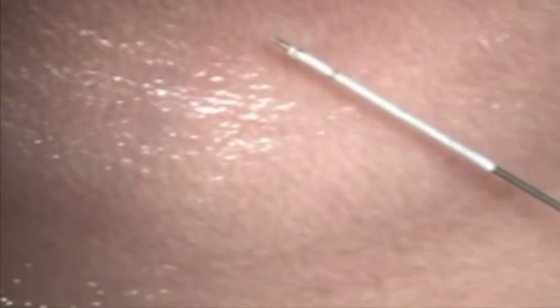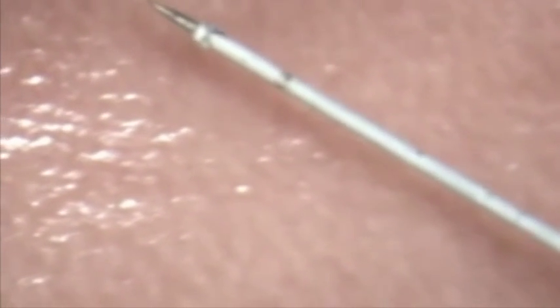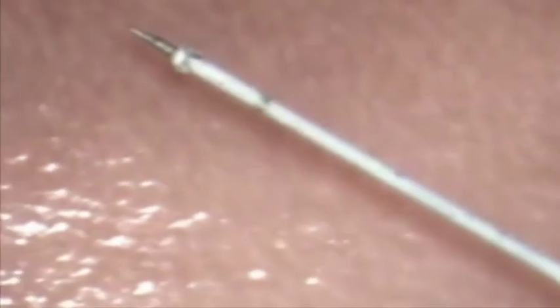This is the close-up of the tip after the surgery has been done. Very simple procedure, costs nothing.